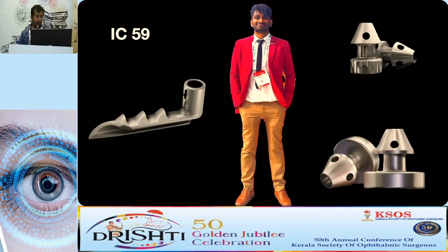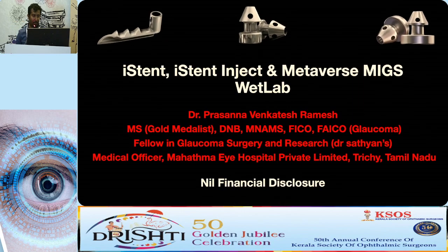So here on the left is the old original iStent, on the top right is the newer iStent, and on the bottom right is the iStent W. That is the iStent W, which has a wider bottom. We will see why the wider bottom is there.